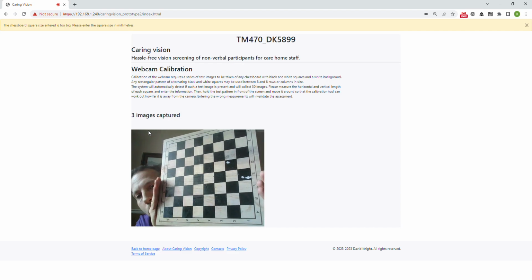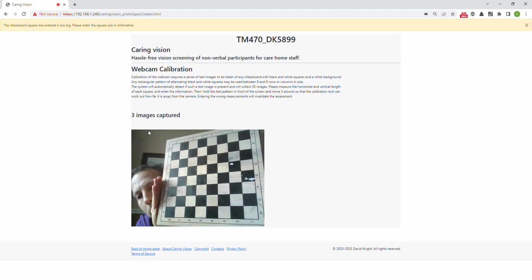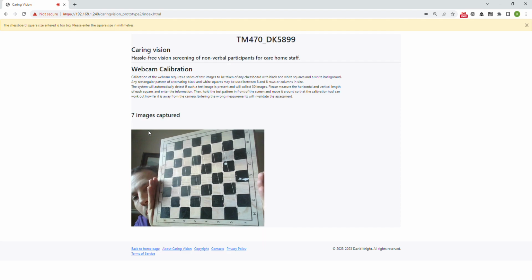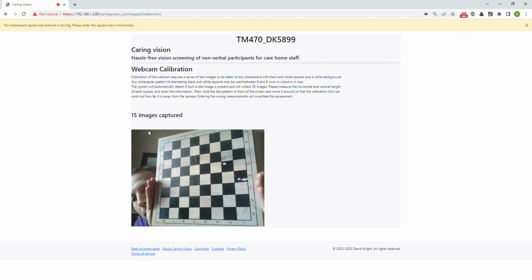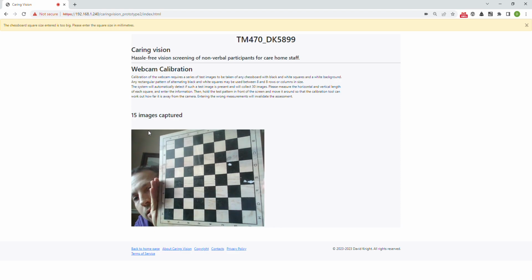So what's happening now is that the system is looking at the input image and trying to find the square patterns, and as it does so, it maps the corners of each square where the squares meet, and it works out the coordinates of each of these patterns.